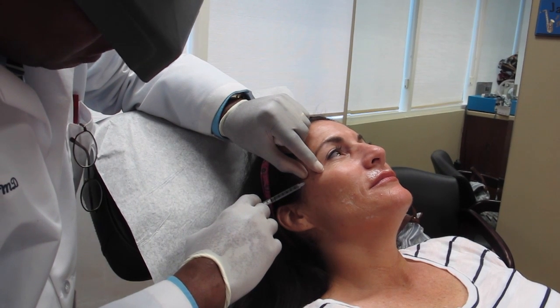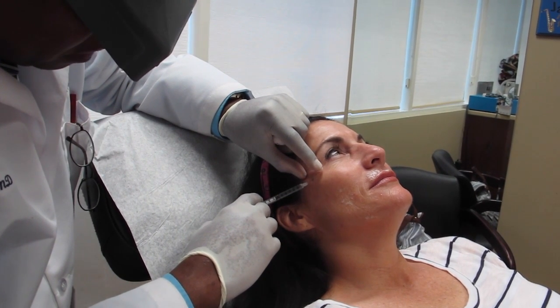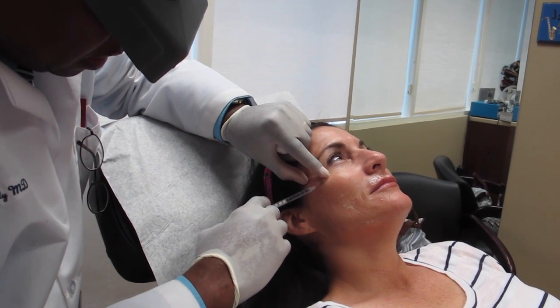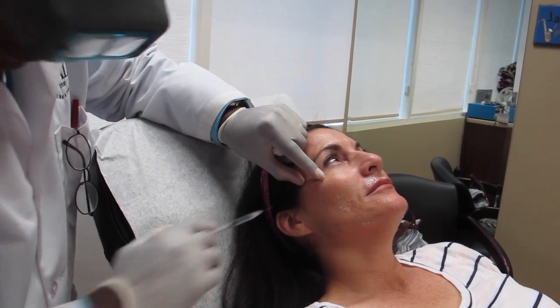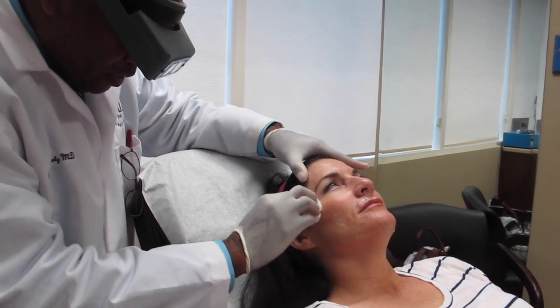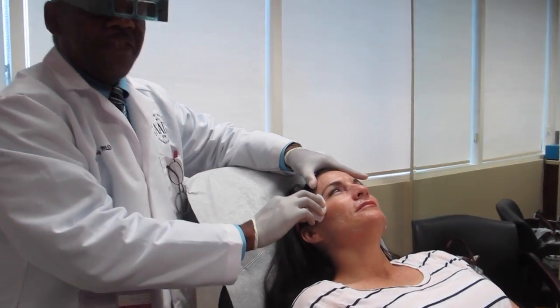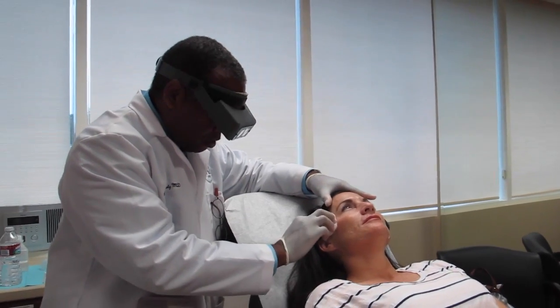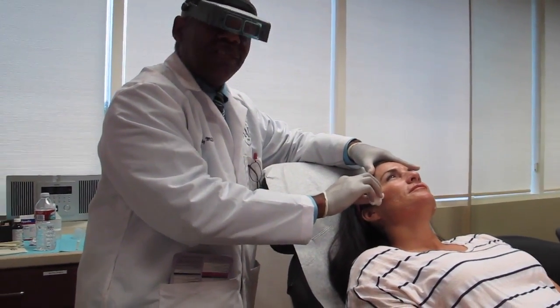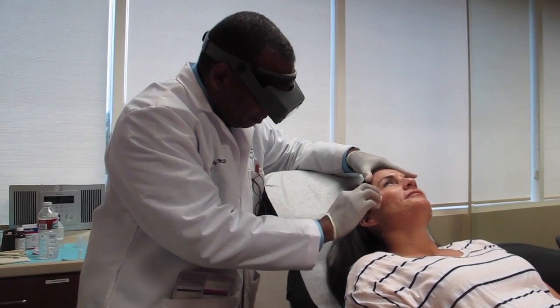The needle for Botox is very fine. It's a 30 gauge needle, so this is not a painful procedure, but then it just softens. You get a little bit of puffiness right after the procedure, but that goes away. Some people will swell a little more, but even so, I'd say usually within the next half hour, that goes away.